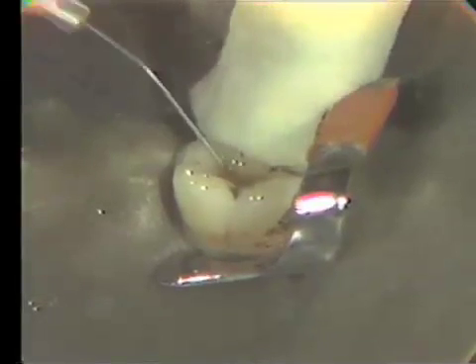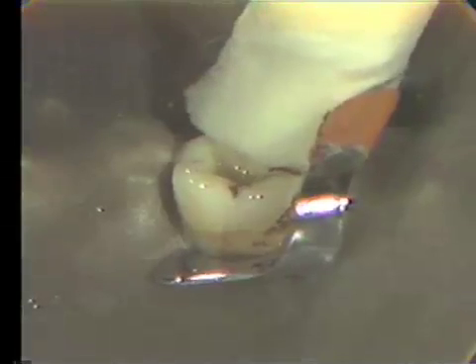Let's say I'm really an inexperienced student and I say I'm going to get that length back. So I pull out my 10, flush, and go back to my 25 — curved properly. I say, well, I guess it's just too small, all I have to do is work, and I work and I work. Now I'll show you a radiograph of what this looks like. As you can see, I got my length back, but it's very easy when you're really forcing to go right out the side of the tooth. Now this will make us very unhappy if we see things like this.